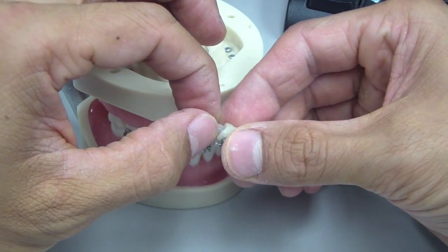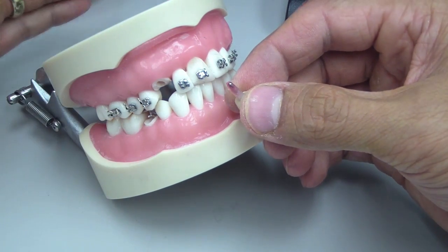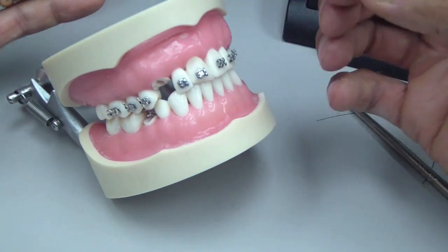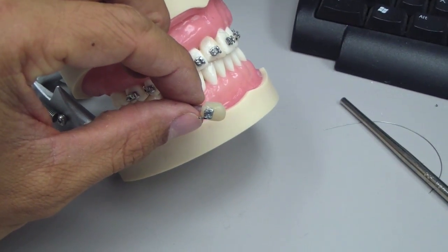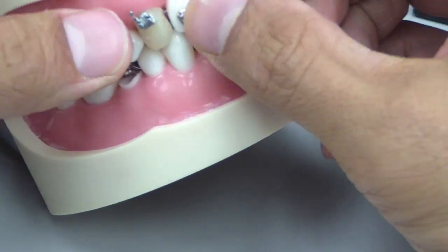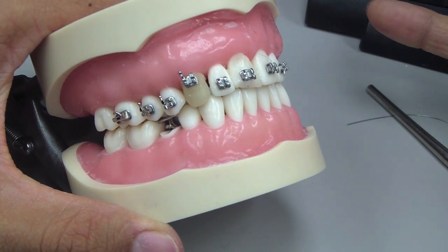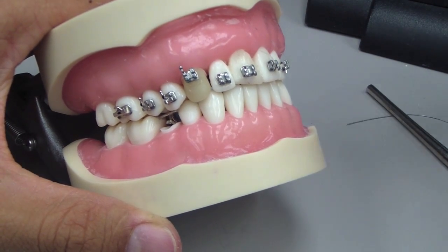Get a provisional restoration on there and lute this intraorally in the canal space. The things to think about are: will you do the endodontic therapy before or after, and what kind of luting cement will you be using? These are all things where you need to really be creative — this is just to get you on that creative process. I fabricated this provisional crown and then had it luted in with a fairly hefty cement that I was able to remove. I'm not going to mention any specific cements because around the world everyone has different types of provisional cements — I leave that for your comments.